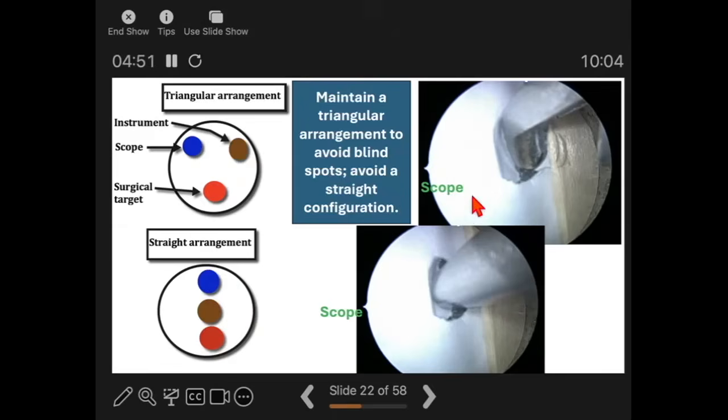Same way, this is the endoscope, this is the cutting edge of the Kerrison punch, foot end, the simulated lamina, which is ice cream stick. So all three are seen: cutting edge of the Kerrison punch, the lamina, the undersurface of lamina.